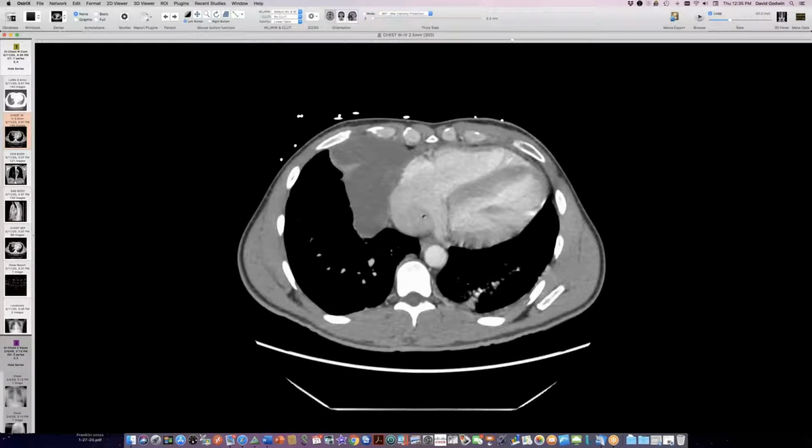I don't know if you guys have seen very many multiloculated thymic cysts, and whether anybody else has a case of recurrence 10 years out. We have one that recurred. Initially, I thought it was going to be like a lymphangioma or something, and those also recur. Yeah, right. It was not. I do have one case that was called a thymic cyst, and it did recur many years later. But yeah, I was pretty sure it'd be a lymphangioma when you first showed it.